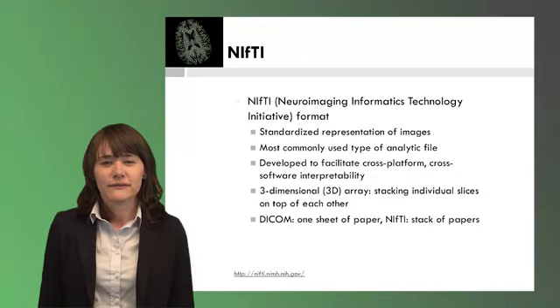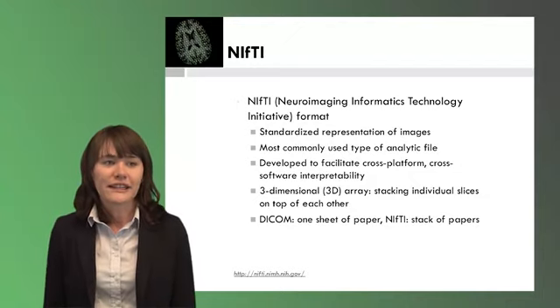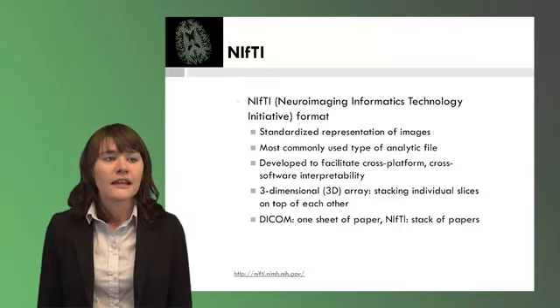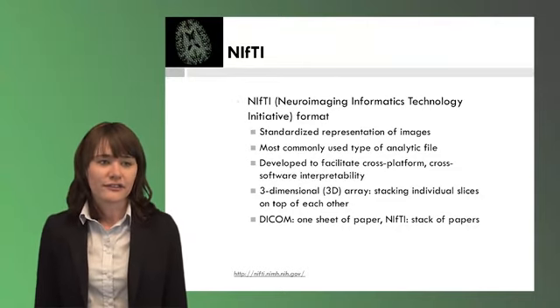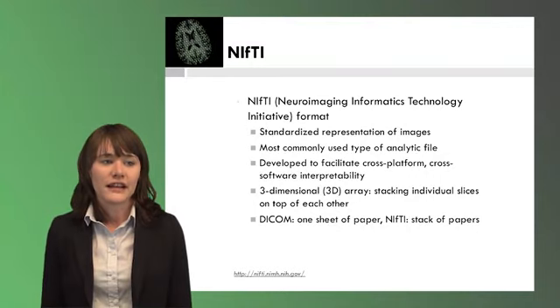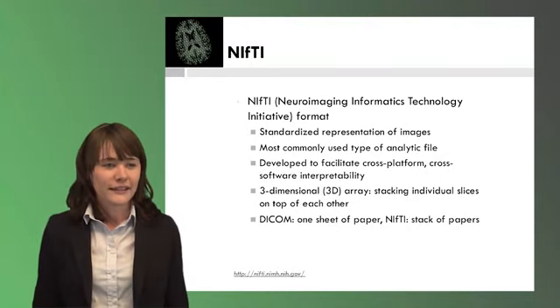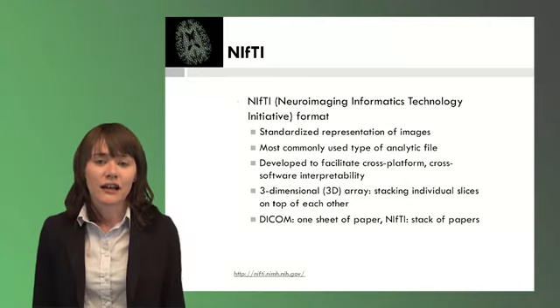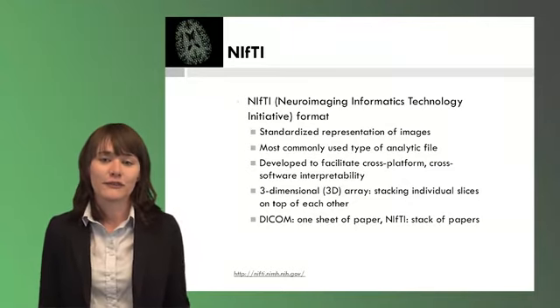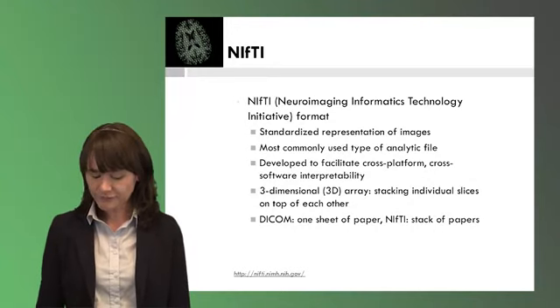These files have been developed to facilitate cross-platform and cross-software interpretability. These images are three-dimensional arrays, so they're stacks of the individual slices that we saw on the DICOM images. A way to think about this is we can think of a DICOM as a single sheet of paper, and we can think of a NIfTI as a stack of papers or as a book.